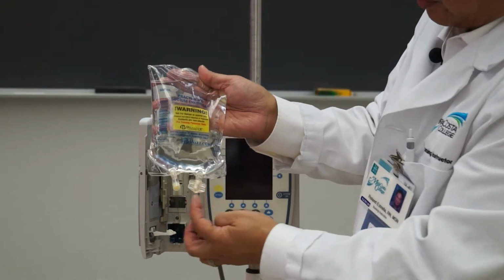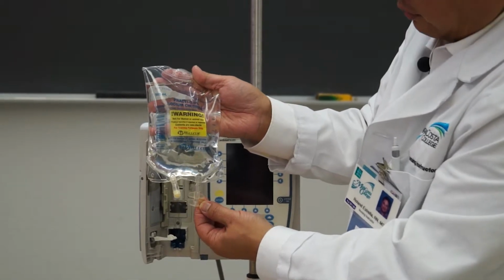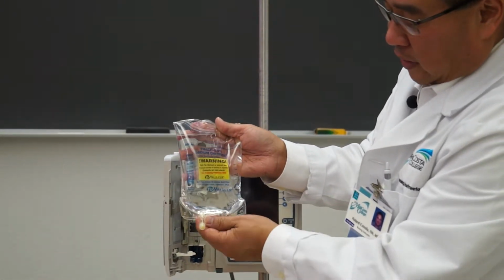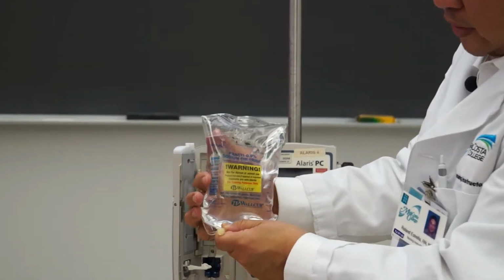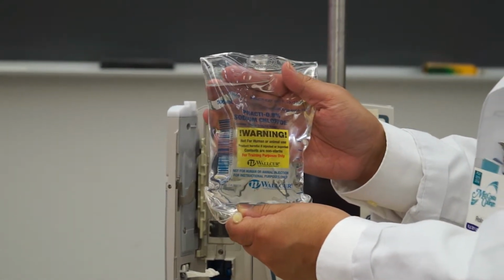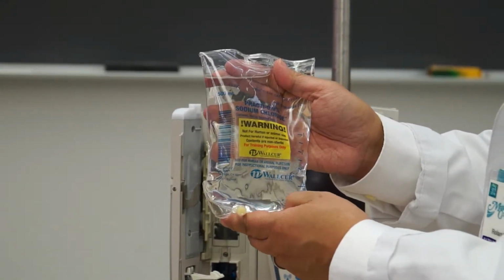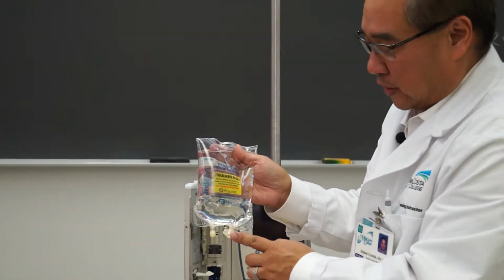On the bottom, you have two ports here. This port on the right side, toward your right, is where you would twist off to actually access the IV bag. The other port here, if you can tell at the bottom, there is a small plastic surrounding a softer area that can be swabbed with alcohol for 15 seconds and then accessed with a needle device. Some have luer locks, and you'll be able to add medication if applicable. In this case, we're not going to use that port, we're only going to use this port right here.